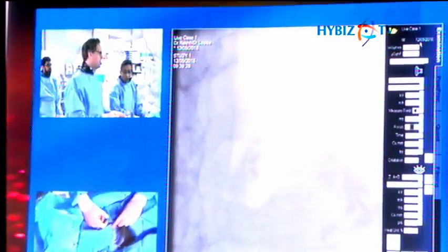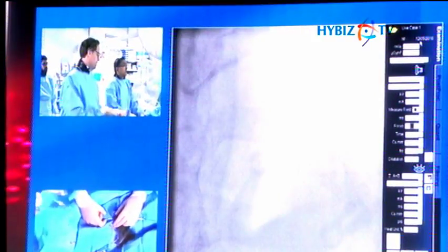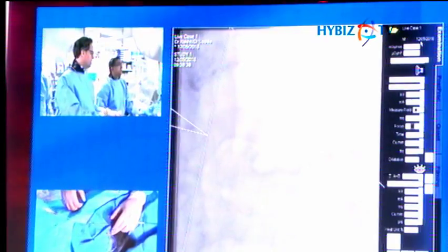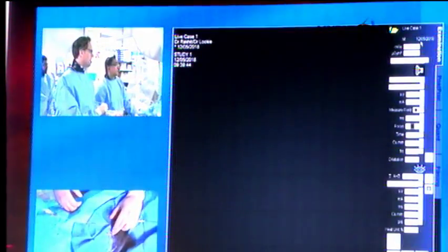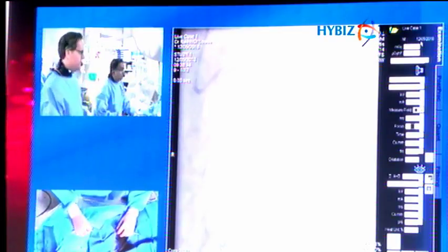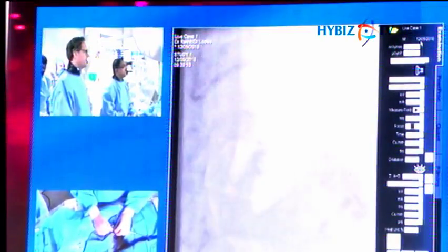So in tortuous vessels or very angulated right coronary arteries, it can be tricky because it's a very stiff device. It's not particularly deliverable. So again, it's all about lesion preparation beforehand. It's also not advised when there's a very, very heavy burden of calcium, just because of the risks of A, delivery, and B, you may not get the best result in terms of the expansion.